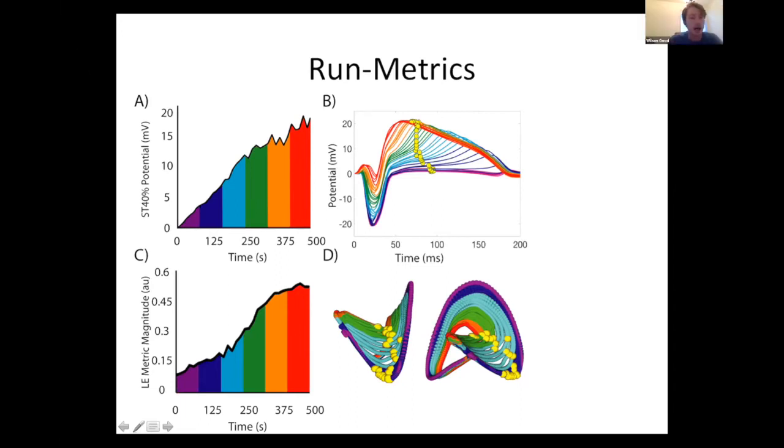Yeah. So there's a couple reasons. One reason, for example, is that when we're looking at that shape, we're looking at the change of 247 electrodes over a typical episode of ischemia in the same amount of pixels that we're looking at a single electrode over an episode of ischemia. So we've distilled quite a lot of information into a single snapshot, right?